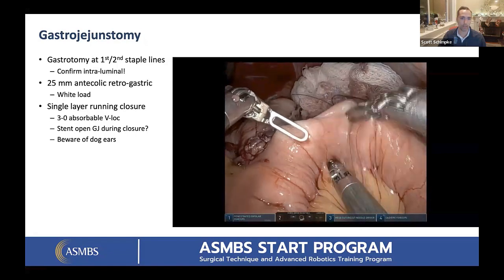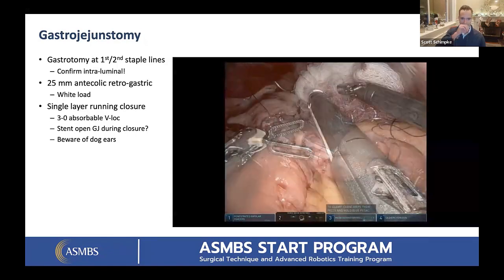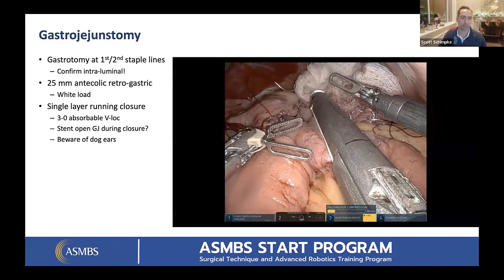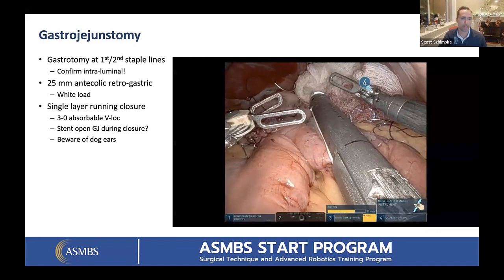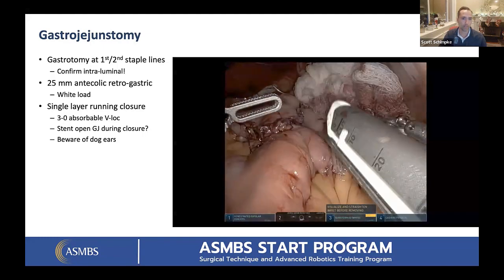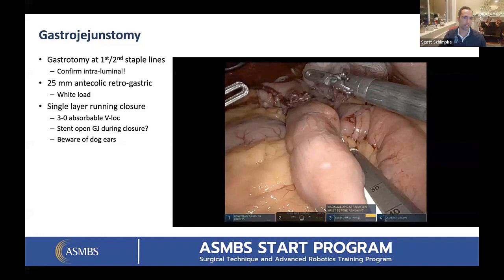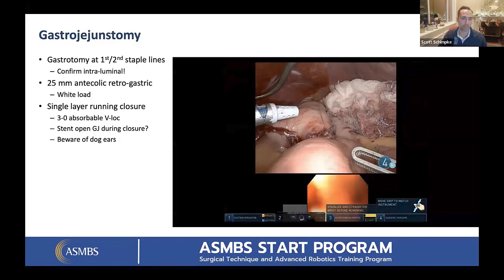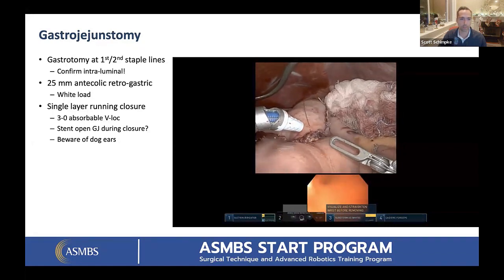One of the tricks I do here is that once I transect, which you can see, making the mesenteric defect there, I keep the stapler in after it's fired, and I use that as a bowel clamp. We scope every single one of the GJ anastomoses at this point to do our leak test. So you'll see I just put the stapler right on the bowel and close it. You can't fire it, obviously, since it's already been fired, but it's basically a bowel clamp, and this is how we do our leak test. Kind of a fun trick to use the stapler as a bowel clamp.